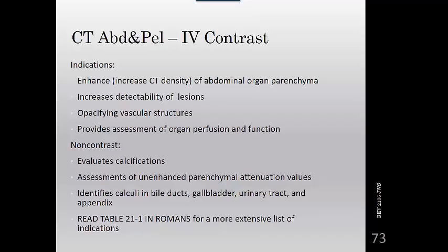It increases the CT density of the vascular abdominal organs, and improves the image contrast between lesions and normal structures. The appropriate timing, rate, and dose of the IV contrast agents are essential, and for most examinations of the body, image acquisition must be completed before IV contrast medium reaches the equilibrium phase.